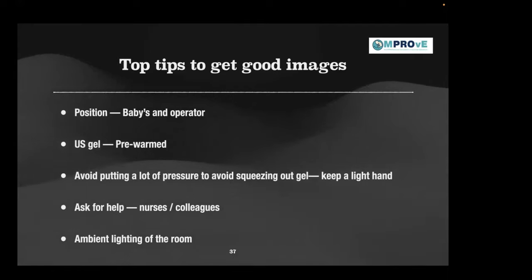So have ambient lighting in the room when you're doing the scan, just shutting the window blinds or dimming the lights while you're doing the scan. It gives you beautiful images. You will get the best of the adjustment on the gain and focus.